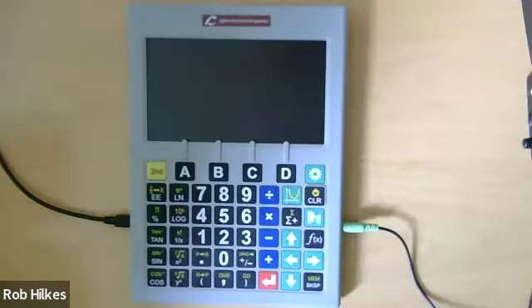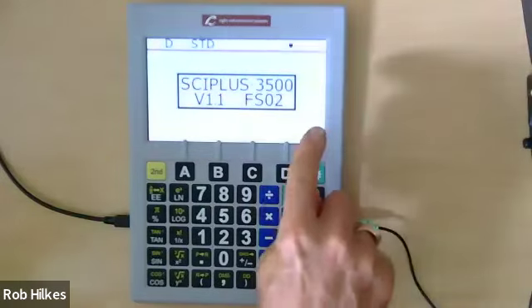Well, one of the things to watch is to make sure that they're well charged. It's very hard to repeat these kinds of experiments, but out of the thousands that we've built, I've seen a couple of times a calculator that's misbehaving and the battery happens to be very, very low. Always make sure, in my case, it's charging.